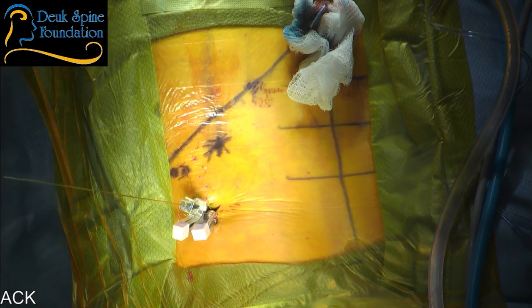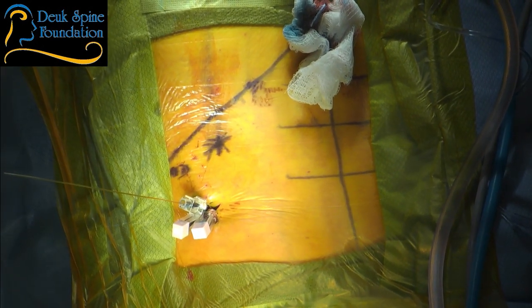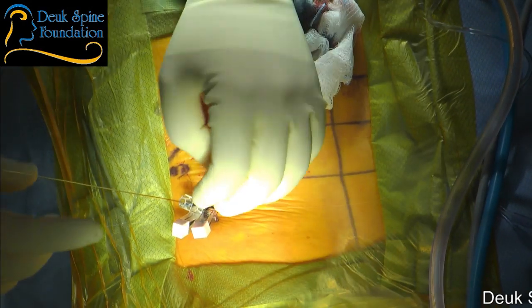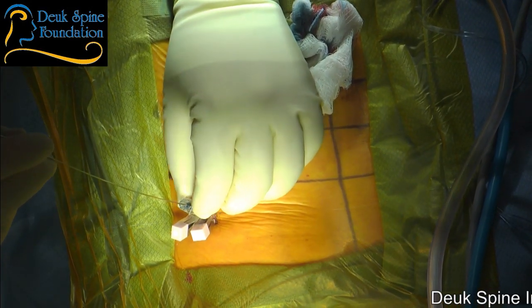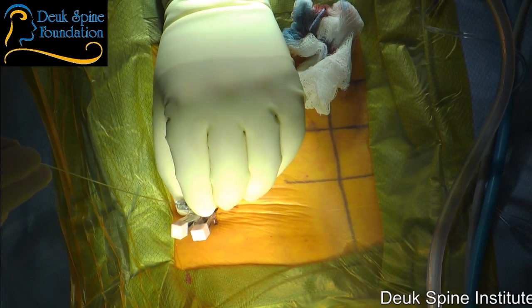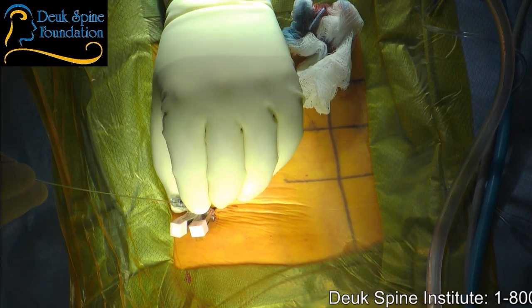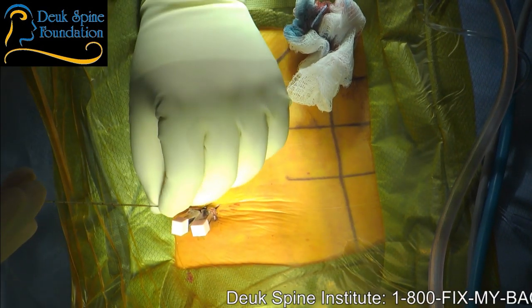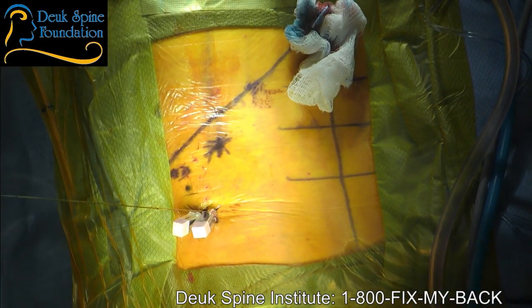Okay, lateral. All right, so you can see we're starting at 3-4. And thank God we have the endoscope to be able to see what we're doing because the x-ray picture is not so good. You're doing great, keep counting out loud.